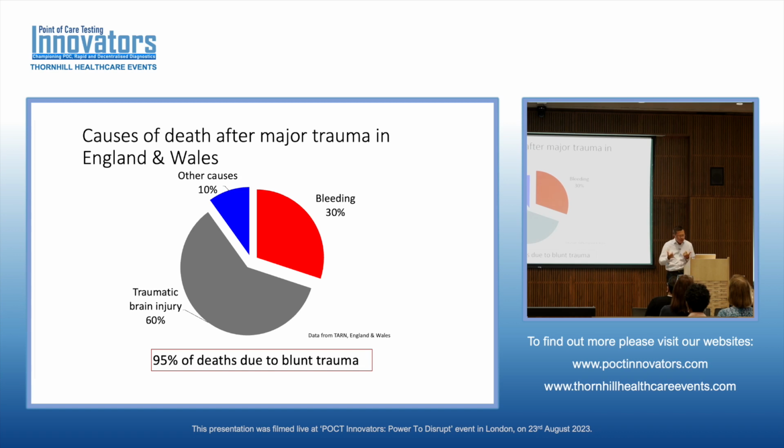Now, why am I presenting that? I'm presenting that because the management of bleeding forms a very, very big part of how we can make an impact into the outcome of these patients after major trauma. And this is where the relevance of the point of care coagulation testing comes in.